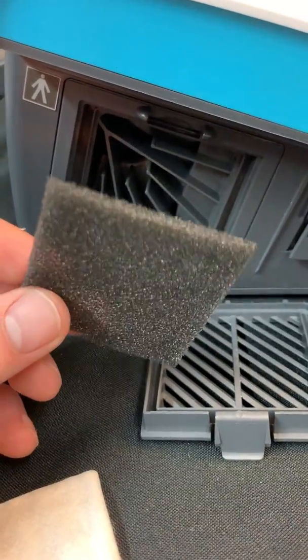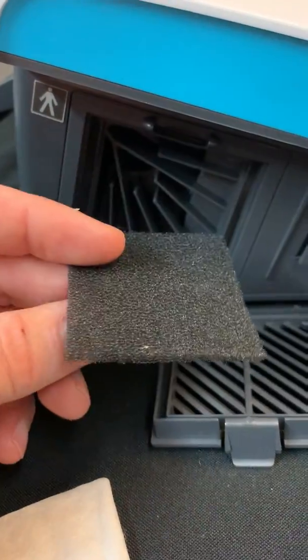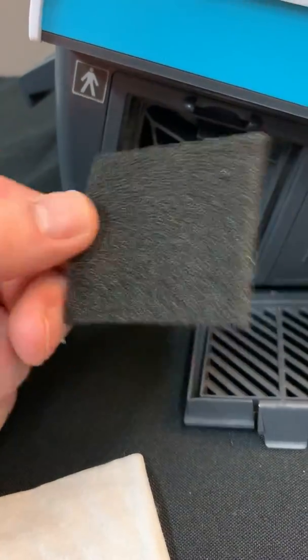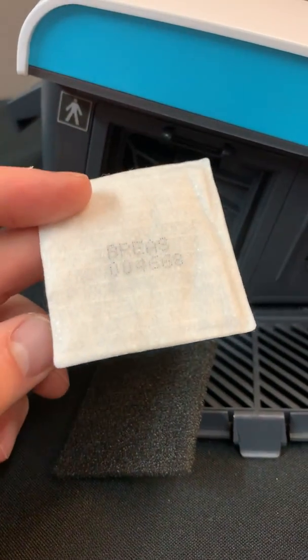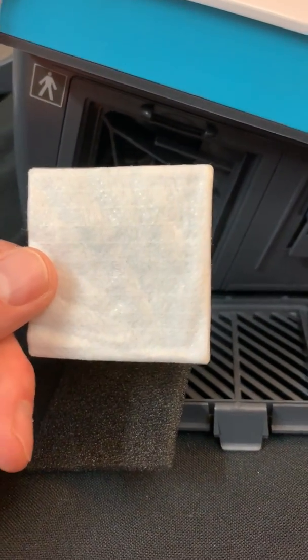The manufacturer recommendation is to change this filter every year, but it is a filter that is required to be in the device as it's running, so make sure that this filter is in the machine. This is a white HEPA filter. It is an optional filter — of course it's for smaller particles — but I recommend changing this filter every 30 days.